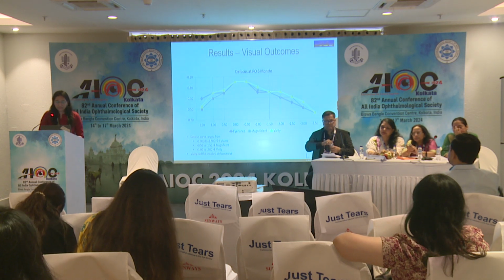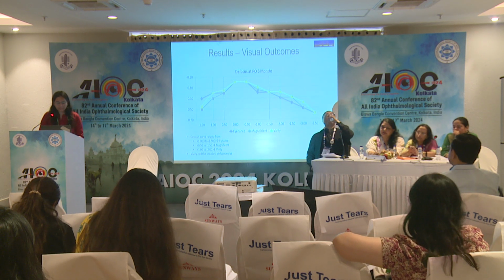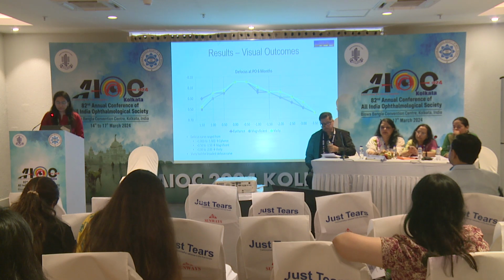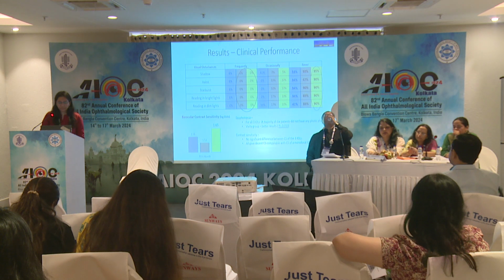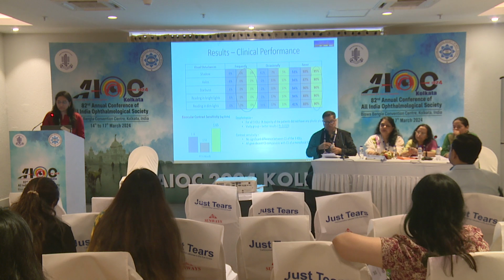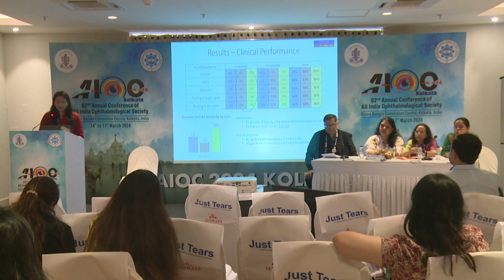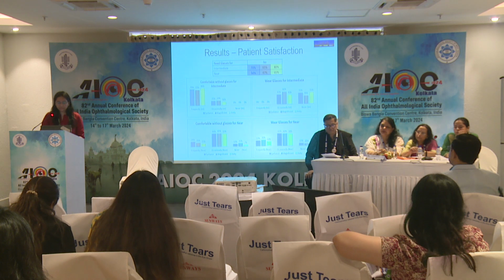The defocus curve at 6 months for all the 3 IOLs showed that Vivity had the broadest defocus curve, extending from +1 diopter to -2 diopters, which translated to a near add of 1.25 diopter. The clinical performance for all the 3 IOLs showed that majority of the patients did not have any photic phenomenon, and out of the 3, Vivity group showed better results, which was statistically significant. All the 3 IOLs gave decent contrast sensitivity, which was comparable to that of monofocal IOLs, and no significant difference between the 3 were seen.